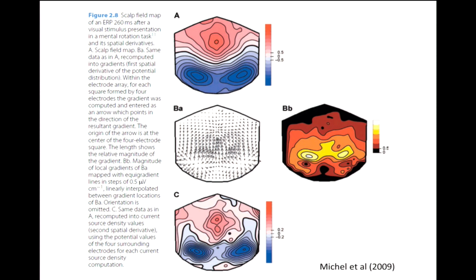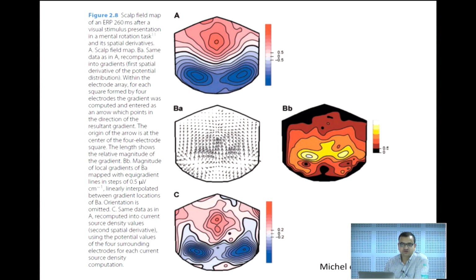Another advantage, which will possibly come up later, is that often you want to understand brain networks or synchrony, the connectivity between different brain regions. If you get a high connectivity between two electrode regions, you can say this is a strong information exchange between them, but it is not certain, because often both electrodes are possibly picking up activity from the same source.